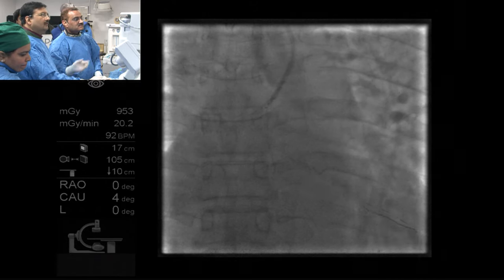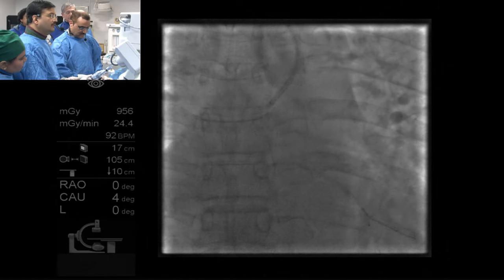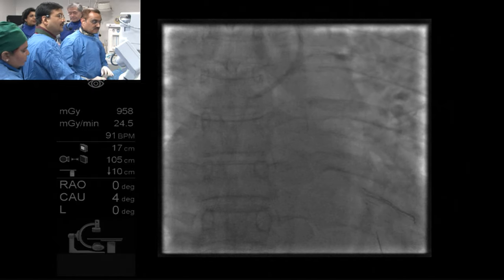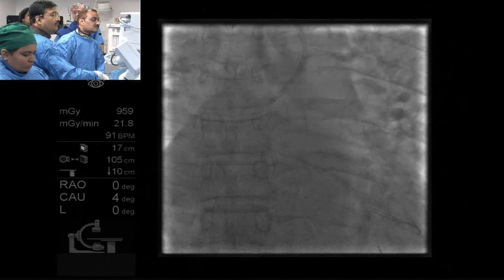No, a loop has formed. Yeah, I think we have a big loop. It'll probably dewire everything and come back in. Let's take it out first. Unless you inflate your circ balloon, then you'll be able to pull it in, I think, because you still have a balloon in the circ. You can use it as an anchor. Yes, that's a good idea. Let me just wire this one up first. We're using all the tricks.